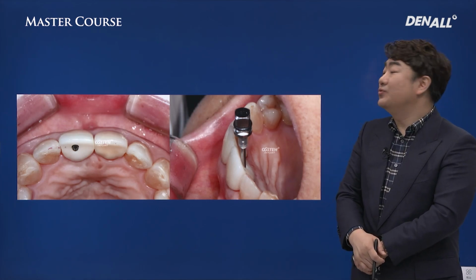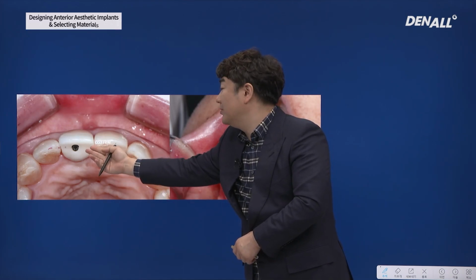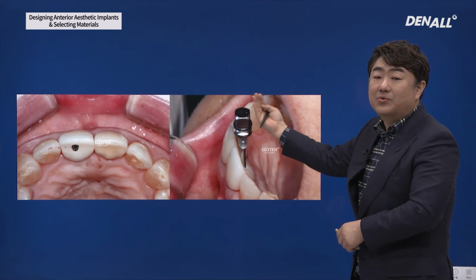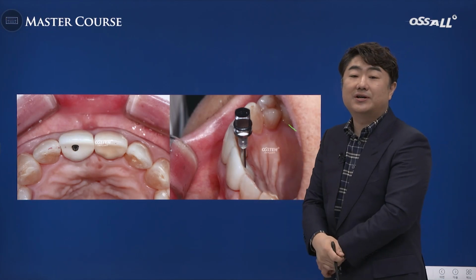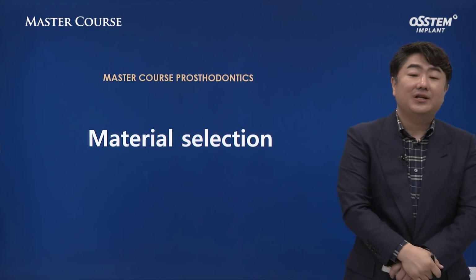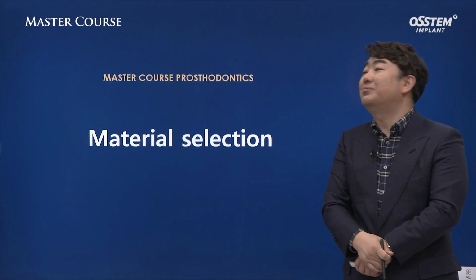After adjusting the abutment, following the changed position, a hole is formed on the crown. You put the angle driver in the abutment, and when you scan this, it can be of help in determining hole position. I've talked about design thus far. I want to talk about material selection right now. There's a slide that I wanted to show you.